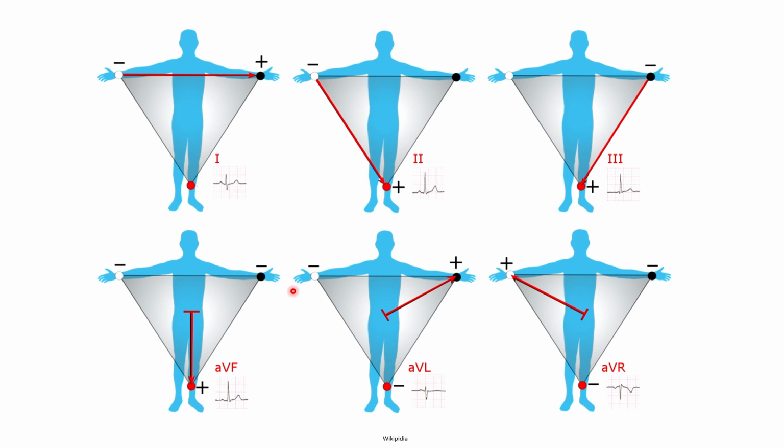And when it comes to aVF, aVL, and aVR, remember these ones are different. For example, we have aVF, and remember the letter F. Remember it as foot, in the inferior. L for left, remember it. R for right side. So in case of aVF, just take the inferior side and take an average of the other two leads.